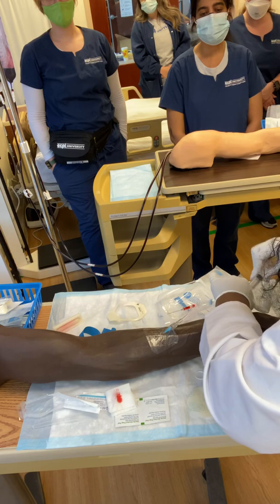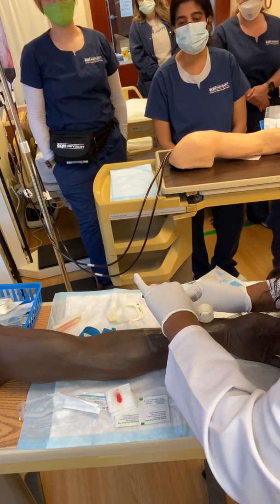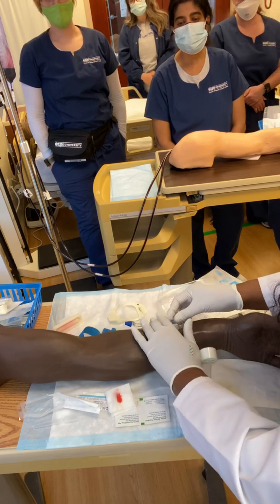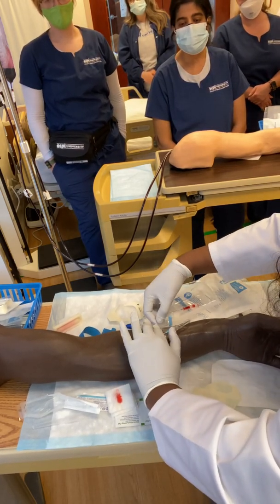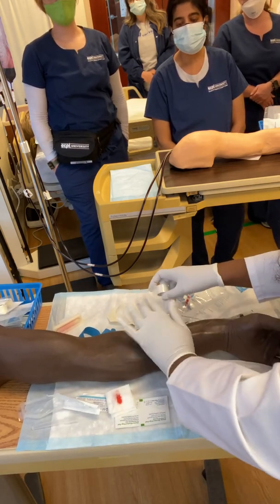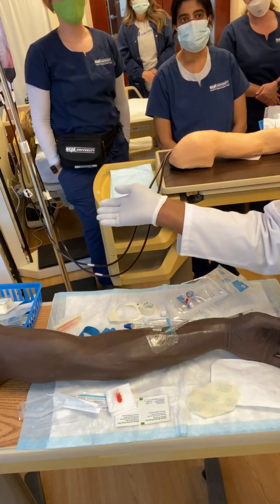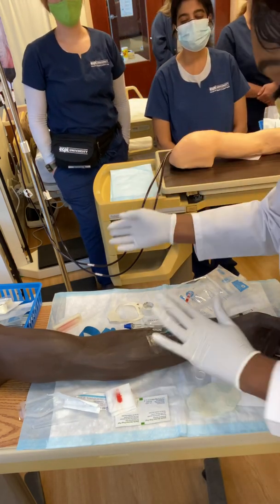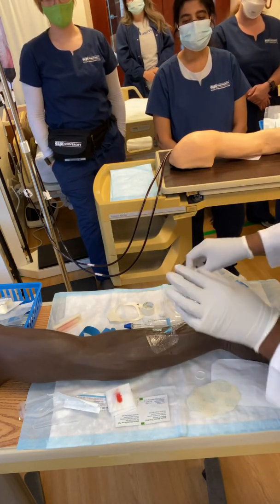And then you can either make sure you clamp this. And then you can use your tape. And then boom. And that's all you gotta do. That's it. Easy, right? You see, mine is raggedy, but it's okay. We get the idea. All right.